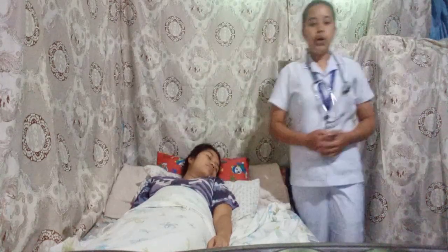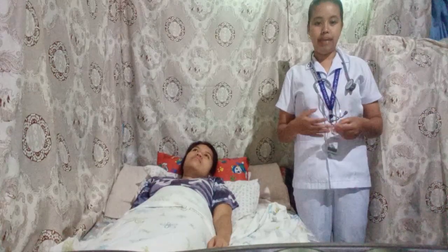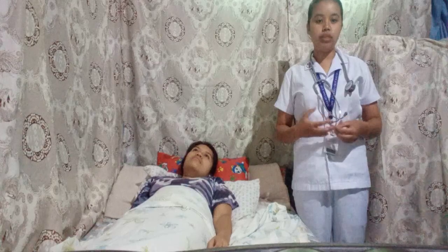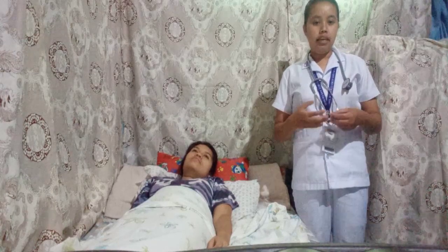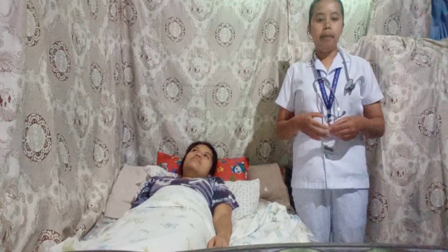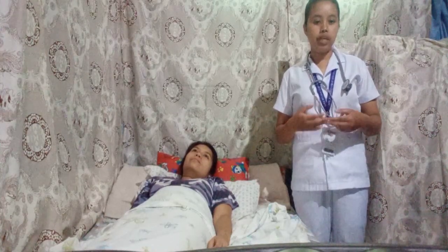Okay. So, next, turn the client's head slightly away from the side being examined. Place the bell of the stethoscope over the carotid artery. Ask the client to hold his or her breath for a moment, and auscultate the carotid artery, listening for bruits. If a bruit was heard, gently palpate the artery to determine the presence of a thrill. Repeat the preceding step on the other side.